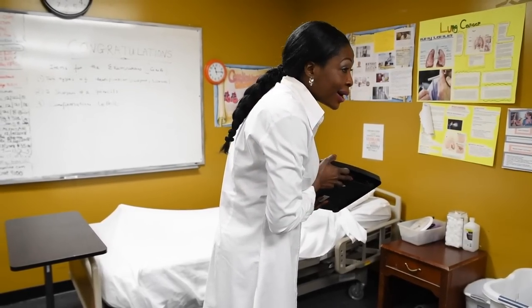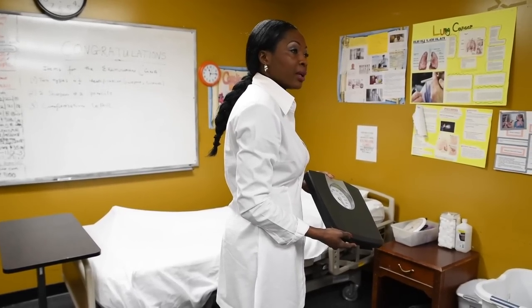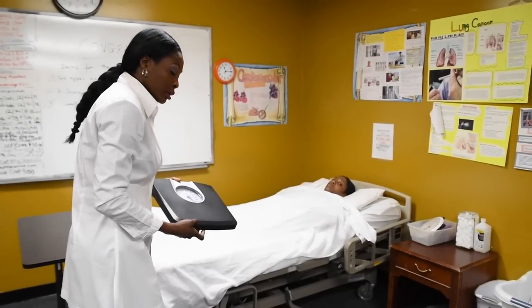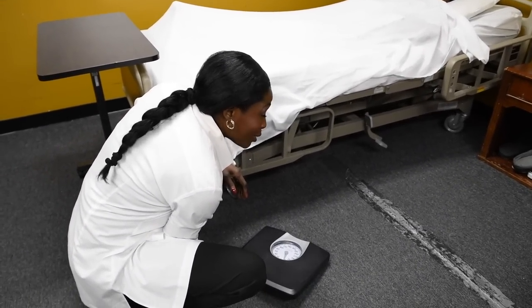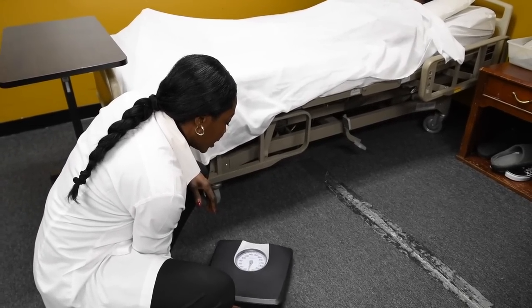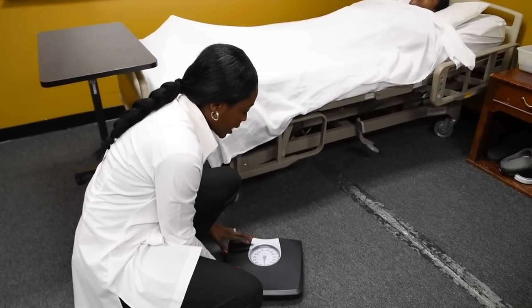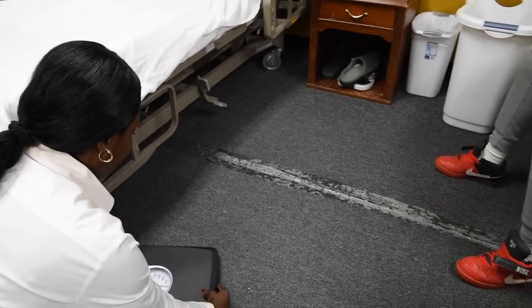There is a line here that the examiner is going to move to take the scale from balance to out of balance. When you bring your scale to weigh your patient, you're going to set the scale on the floor. If you have long nails, it would be difficult for you. As you know, we're not supposed to have long nails anyway. When you are trying to balance your scale, you should not rest your other finger on the scale, or else you'll be here forever. So you're doing it with one finger, basically.